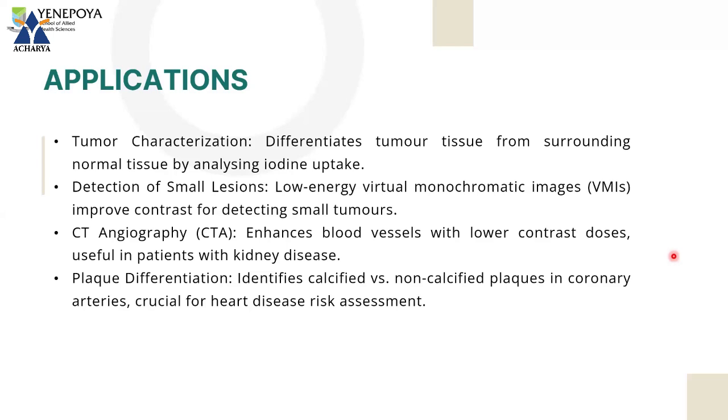Your enhancement of the blood vessels will be high with lower contrast doses. So you don't have to give a lot of contrast media when you are doing angiography or any other case, which will also help particularly when you are scanning patients with acute kidney injury or CKD.